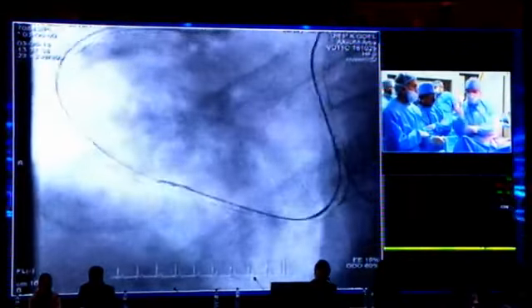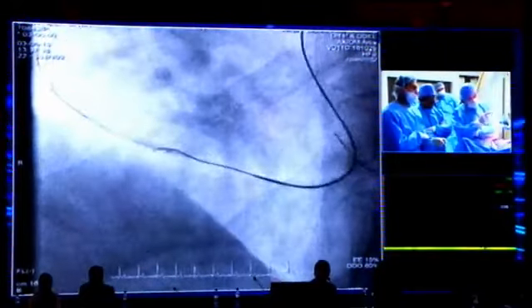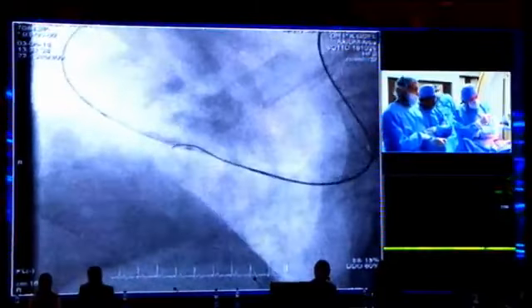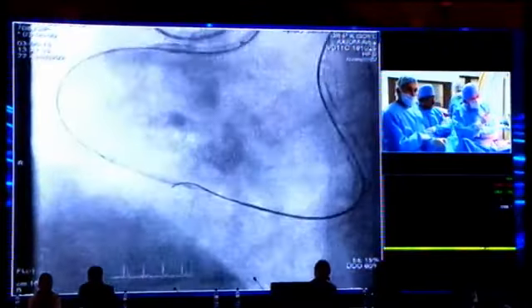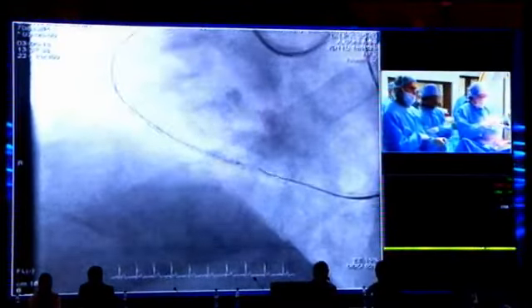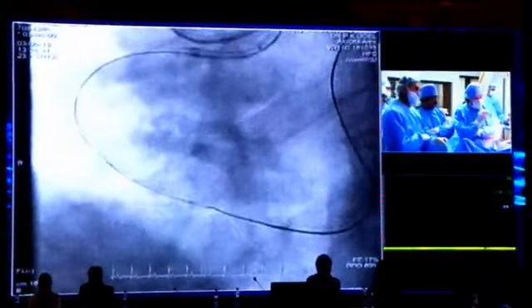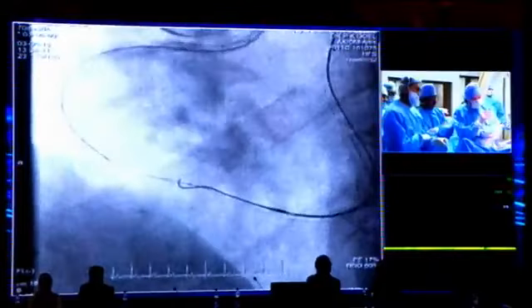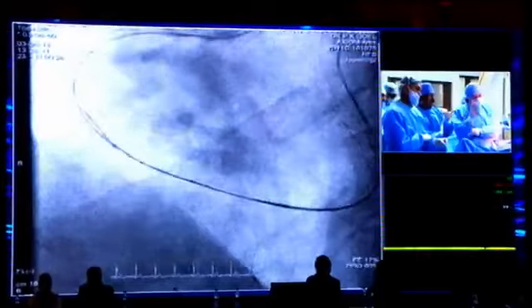We keep you a little bit under suspense. So here is the Corsair coming now. Yeah, you could advance the catheter or microcatheter into the distal RCA. And now we have more control. Next. So this is now where I try to get a little bit more in the sequence of the balloon. The balloon is inflated, deflated, space is created, and now we are through.